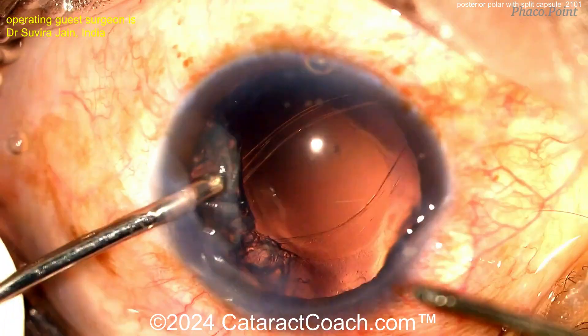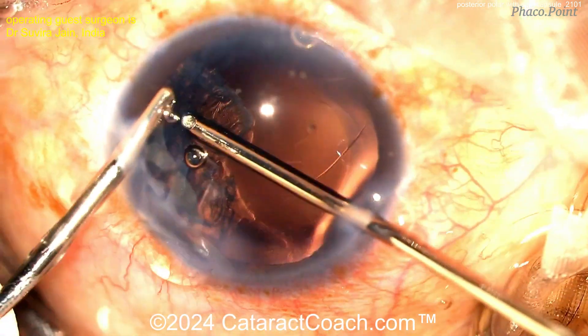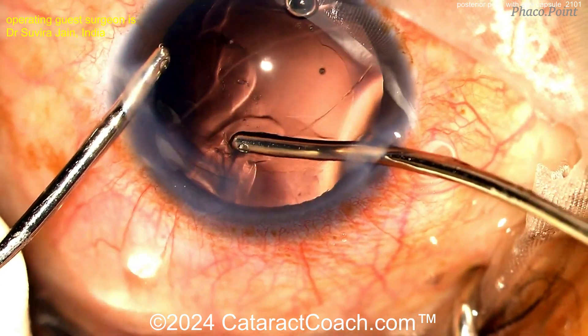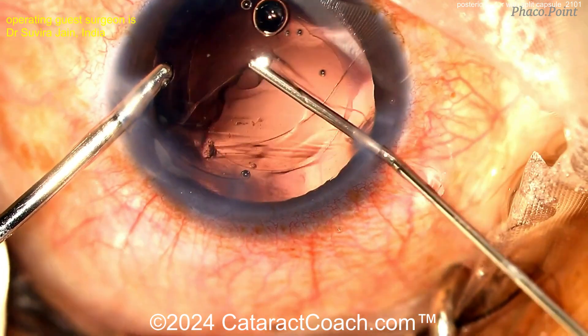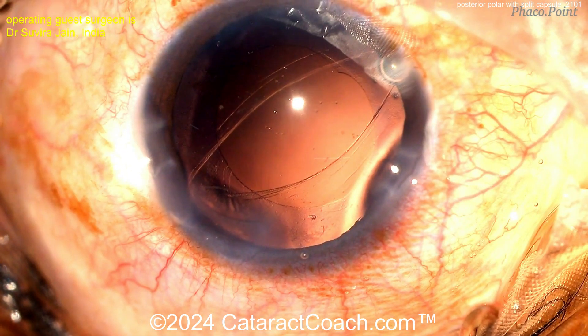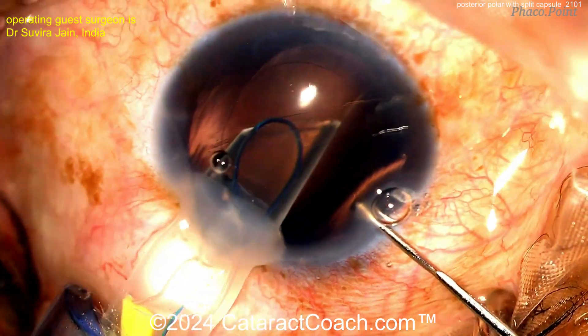Now probably switching hands — aspirator in the right hand, infusion in the left — and getting all the rest of this lens material out, taking your time. That'll come out very easily. It's all about keeping the AC formed and not letting the vitreous prolapse. More viscoelastic. And now with that beautiful anterior capsulorhexis, you can certainly get a nice lens inside the eye. There's that capsulorhexis — and the posterior capsule is definitely split wide open. There's been no displacement of any nuclear or cortical pieces.